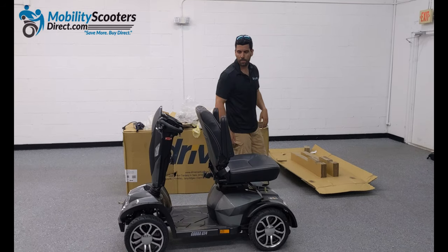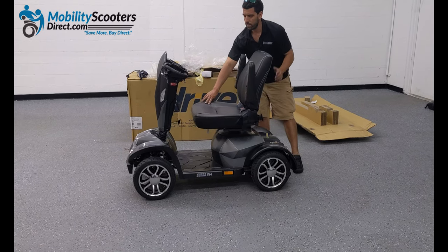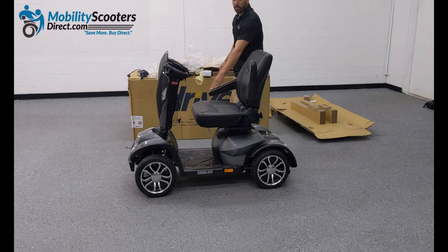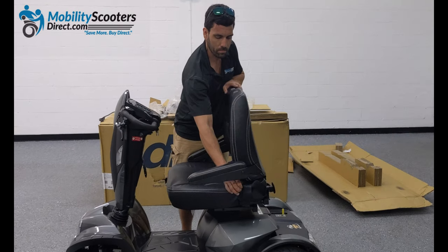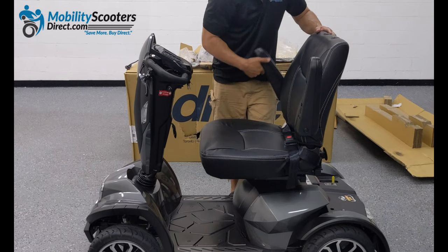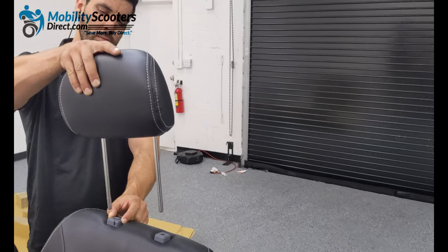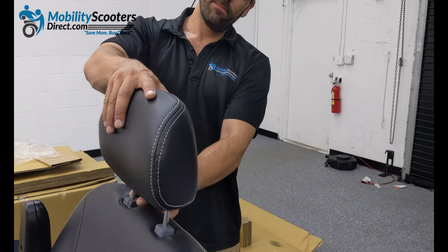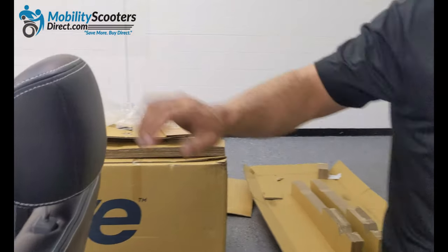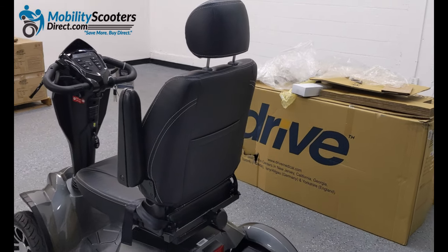The armrests do flip up and the chair itself has a semi-recline feature — it doesn't go all the way forward or all the way back. The headrest is removable and has three positions that it can lock into, very similar to the headrests of an automobile. In the back of the seat there is a pocket, and it has nice white pinstriping on the seat leather.